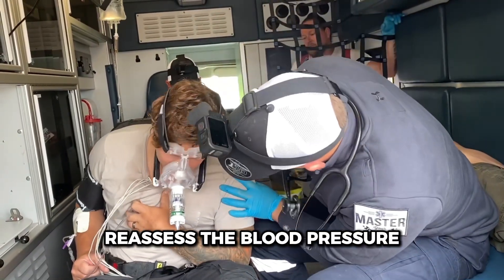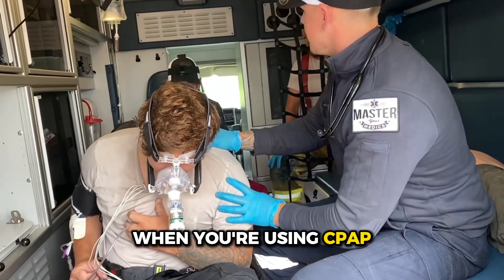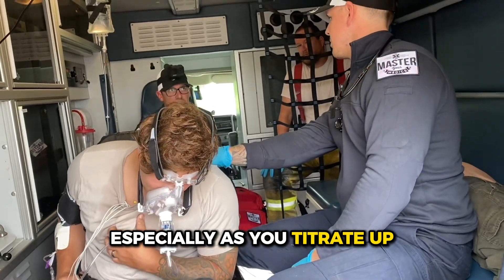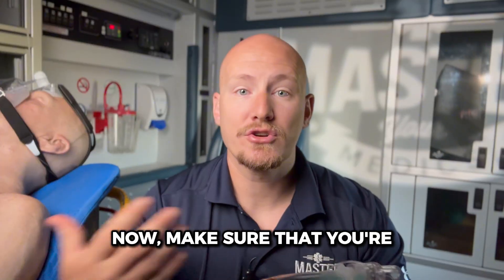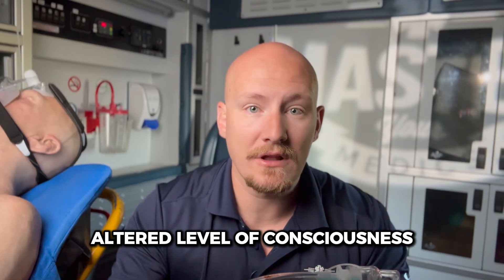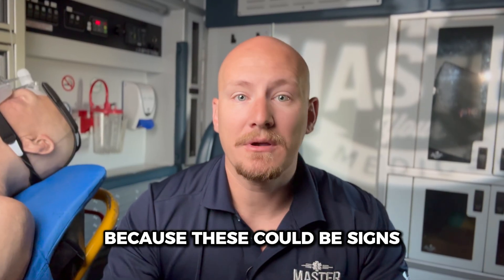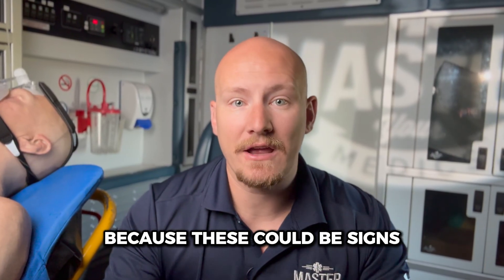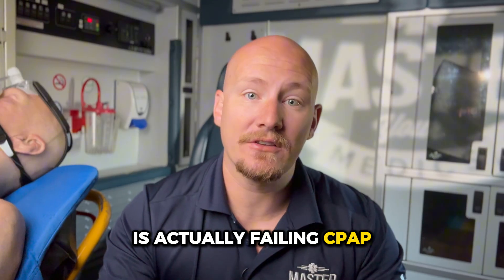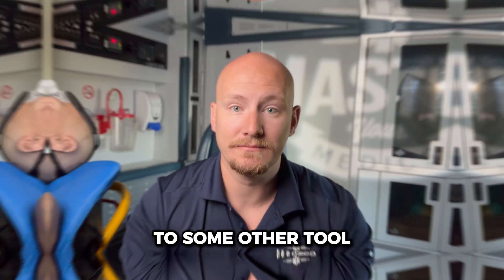Reassess the blood pressure. Remember that preload will drop when you're using CPAP, especially as you titrate up. Watch out for fatigue, an increased altered level of consciousness, or anxiety — because these could be signs that your patient is failing CPAP and needs to be elevated to some other tool.